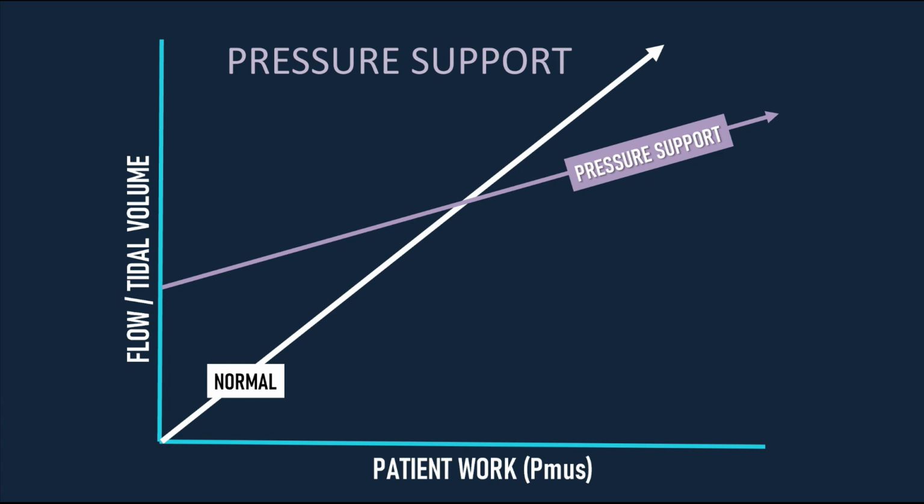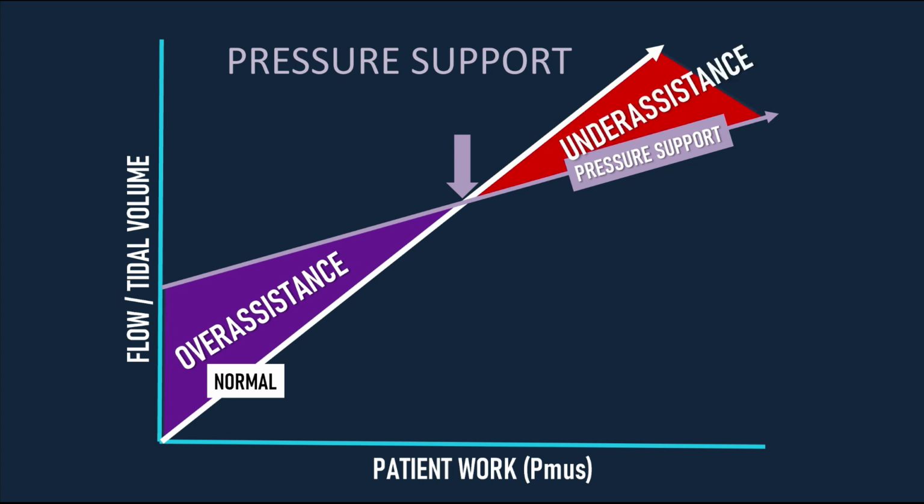You can see that compared with the normal line, initially with pressure support, there is over-assistance that diminishes as one arrives at the sweet spot. Beyond that point, there is under-assistance, an elevated work of breathing that leads to gasping and fatigue.